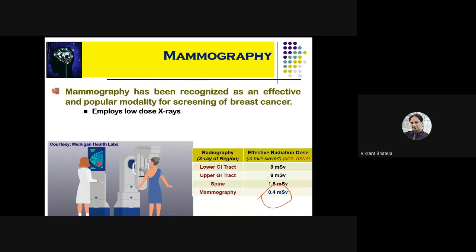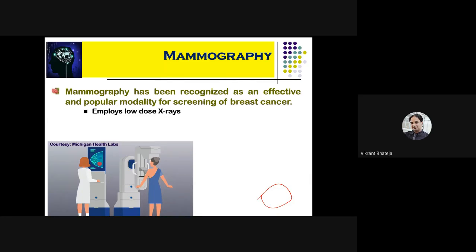Now again, there is a reason behind it. If somebody is going in for a particular type of screening, then initially no one knows whether there will be some investigative finding or not. Now suppose a heavy dose of X-ray is used there, then the problem is that the X-ray dose may trigger the cells, and just by getting that X-ray done, the non-active cells in the region can eventually be converted to active ones.